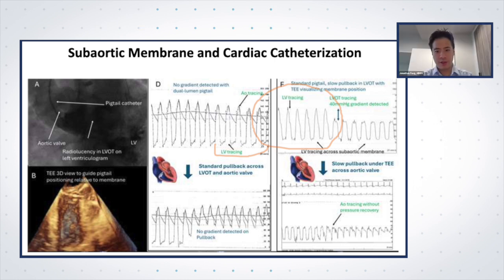Yes, it was a very slow process. It's kind of more like a catheter positioning than the pullback, but we did see a change in this. I assume the membrane was allowed to resume its original position, but it doesn't act like a valve where it completely shuts the outflow tract. That's why I believe it looked distinctly different from that of an aortic tracing.